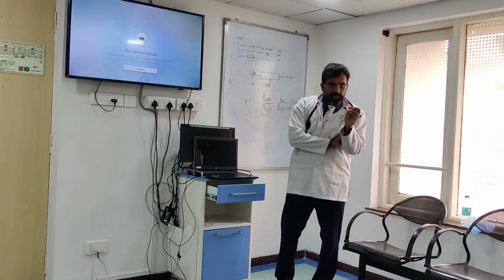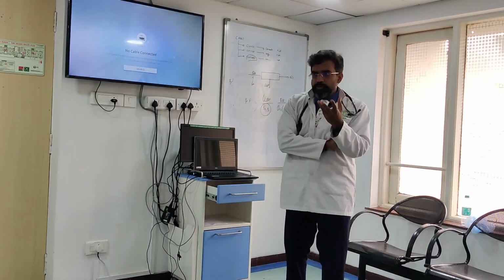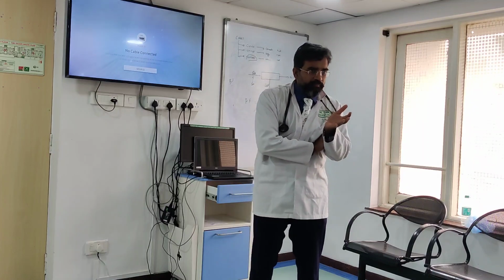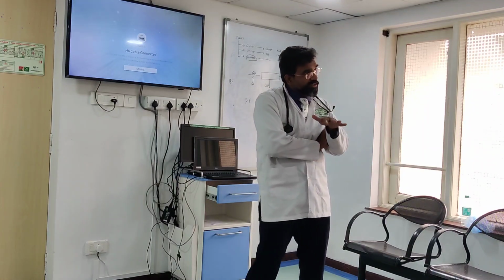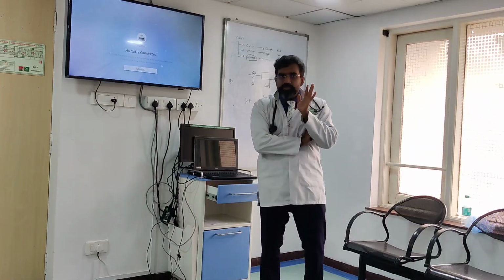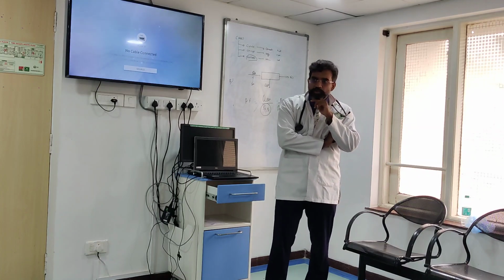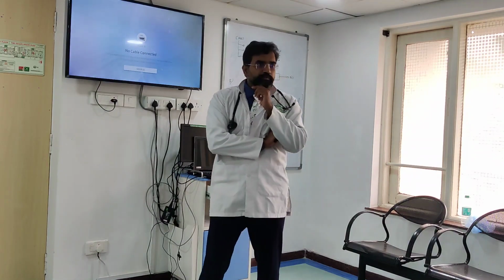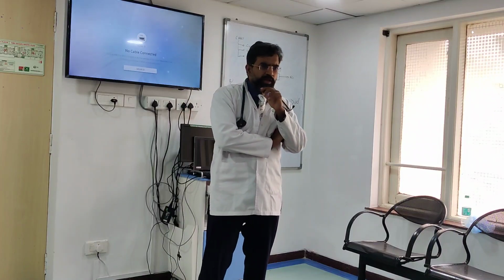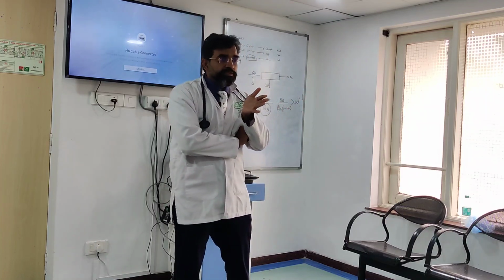Now let us tweak it a little bit, and I'll give you a case scenario, now that you understood what happens with diffusion, what happens with convection, what about combined modality? I'll give you a case scenario and you tell me what you are going to do. I have a patient who comes in with hyperkalemia of 6.1 and acidosis with bicarbonate of 7, and he's hemodynamically stable.